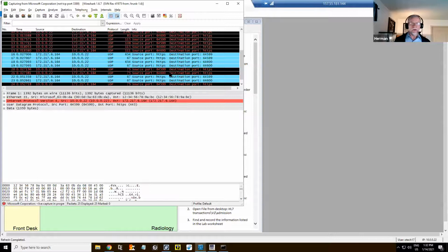Now, if you're not familiar with what's going on in the networks, you might be really surprised: wow, I don't do anything, but what's going on? What is all this talking? There's all this background chatter of this virtual machine talking with the host, making sure everything is okay. So there's a lot of chatter typically going on, right? So you need to see something. If you don't see anything, then we're not listening, or we're not connected to that interface, for example.